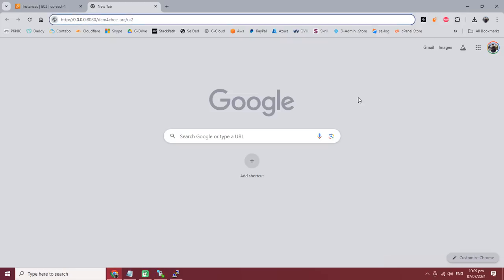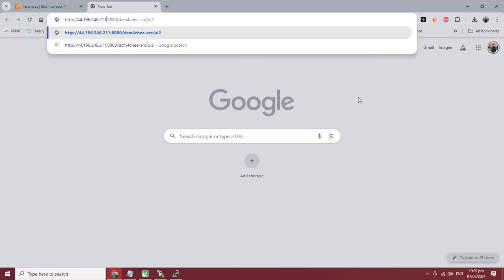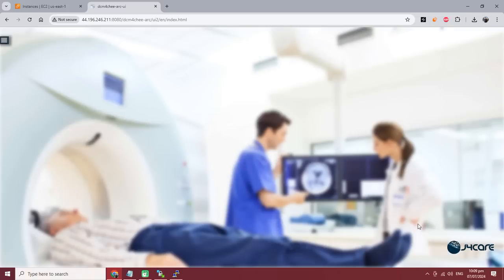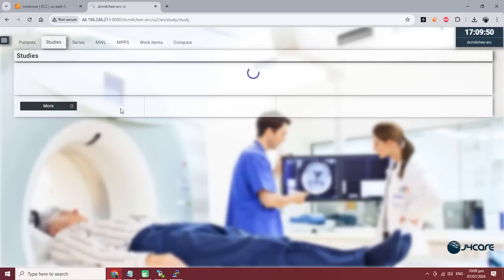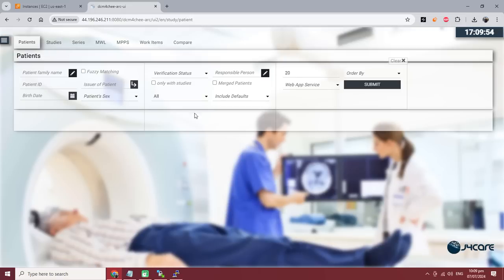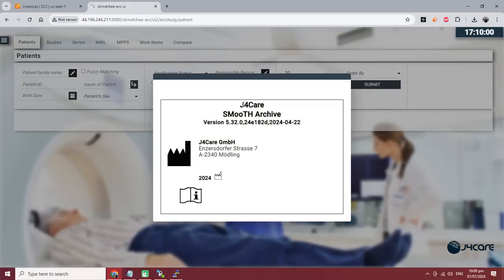Here we go — your DCM4CHEE is installed. Very simple steps. This is DCM4CHEE Archive 5.